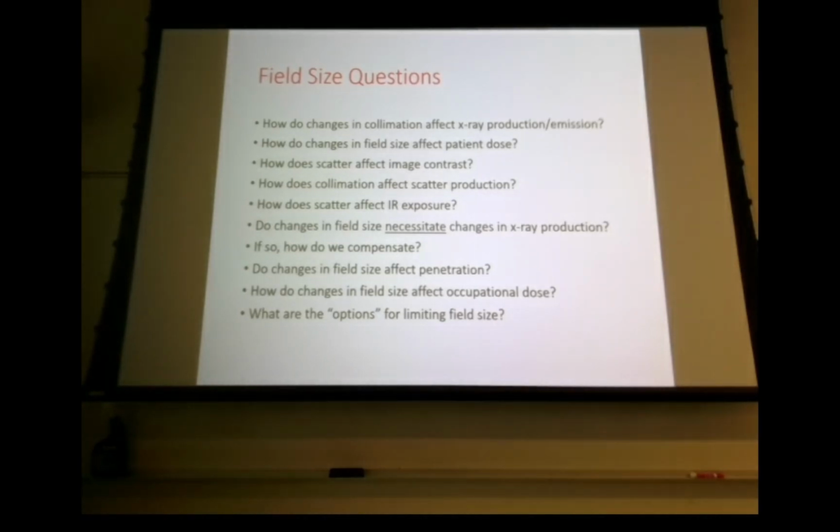2. That's if you need to repeat an exam, you need to double it, right? But your rule of thumb for pathologies, say you have an additive pathology, you need to increase your mass by 30 to 50%. Same thing here. It's stock answer is 30 to 50%. So again, you can test this out in clinicals.